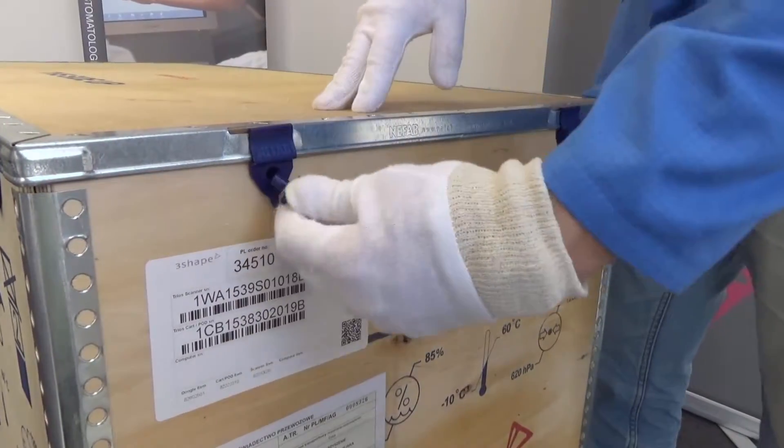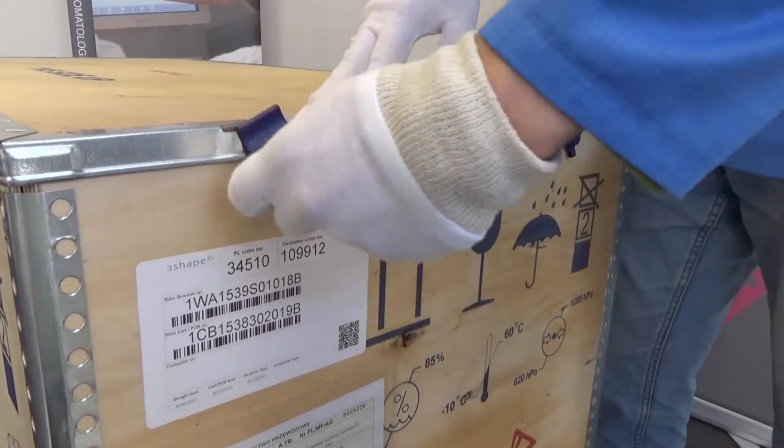To open the 12 plastic clips holding the lid, you need a flat-headed screwdriver or special tool.